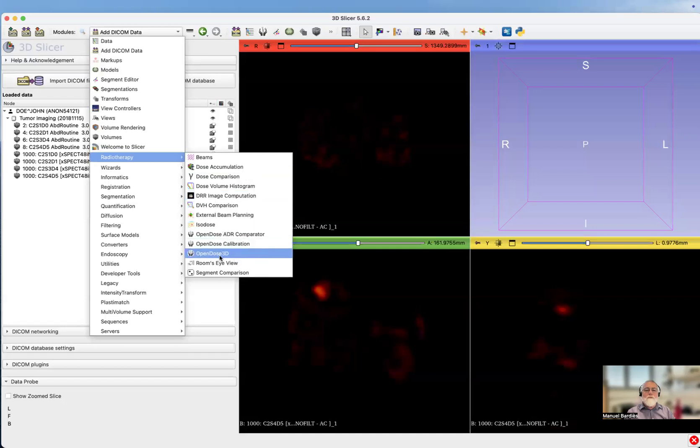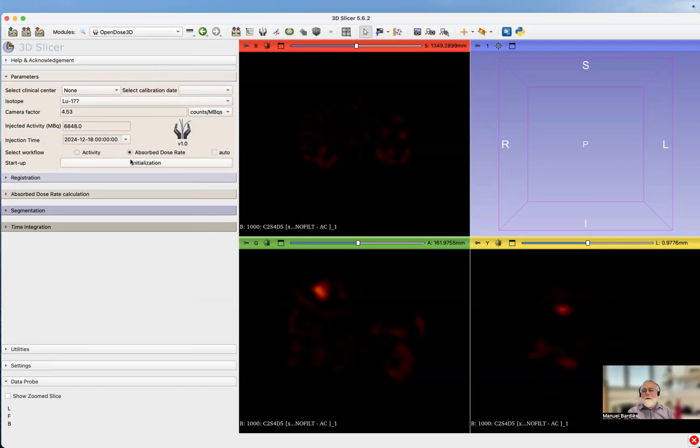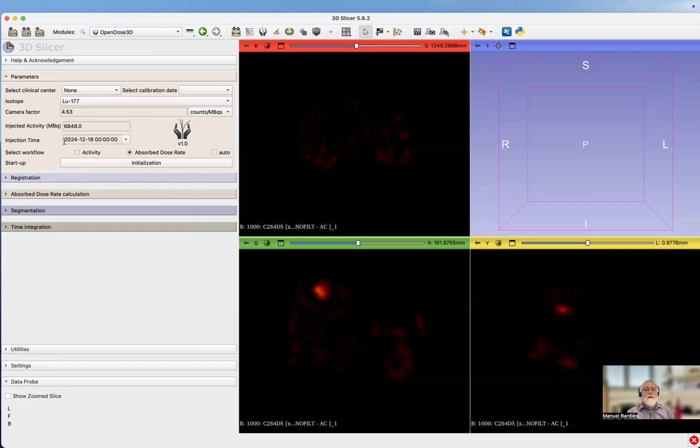We select the OpenDose 3D extension in radiotherapy, and here we go. We have the first panel, the welcome panel of OpenDose 3D. We need to check it's version one, it's fine.